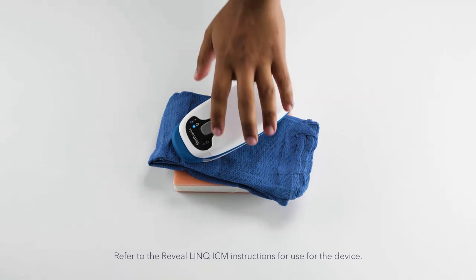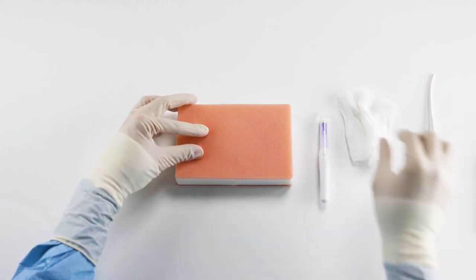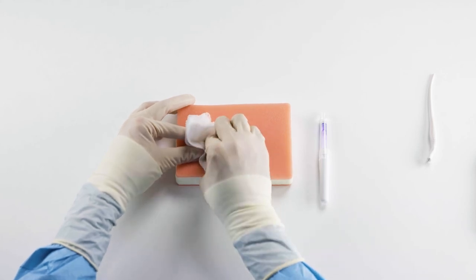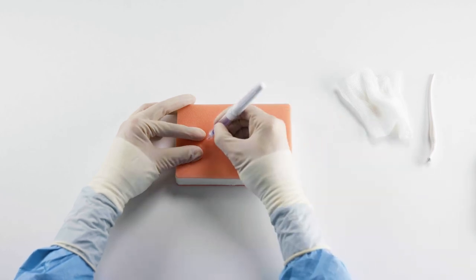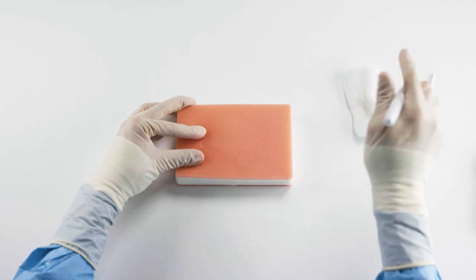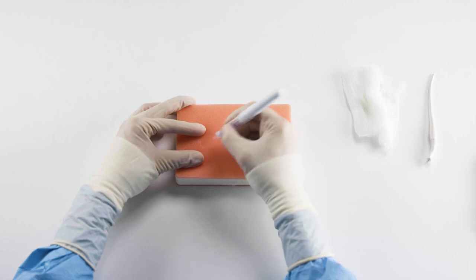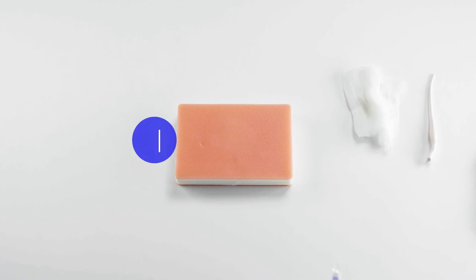I'm told the R-waves look good. If needed, you can always inject one cc of lidocaine with epinephrine on the surface to control any bleeding. You want to make sure the bleeding is completely controlled before applying Dermabond, which is my preferred closing technique. The bleeding appears controlled, so I'm going to crack my Dermabond and put a few drops inside the incision. I'm going to pinch the skin to make sure that inner layer of the skin is approximated, then apply another layer of Dermabond on the surface layer and allow that to dry. We've completed the Medtronic Reveal Link insertion and the patient is still smiling.